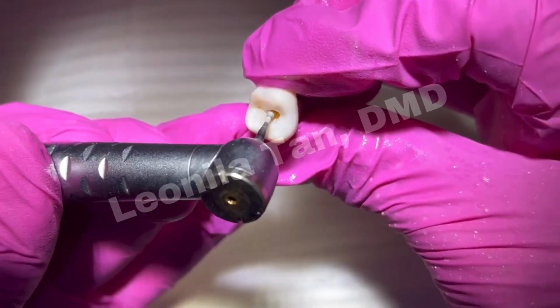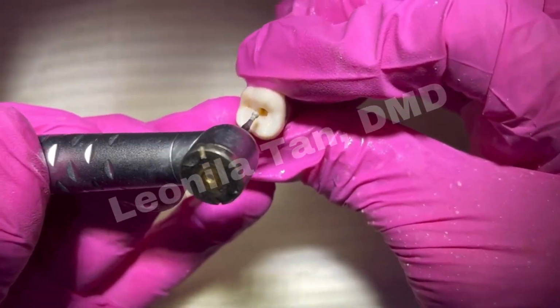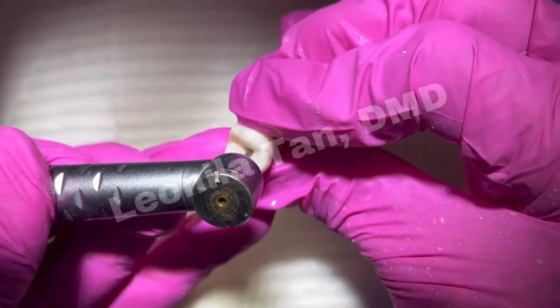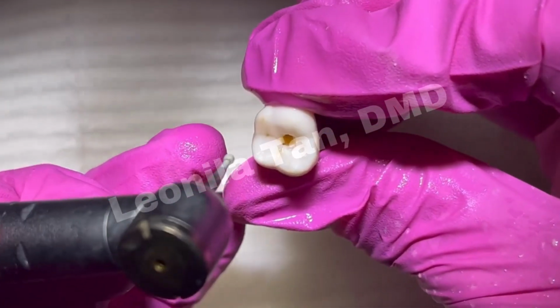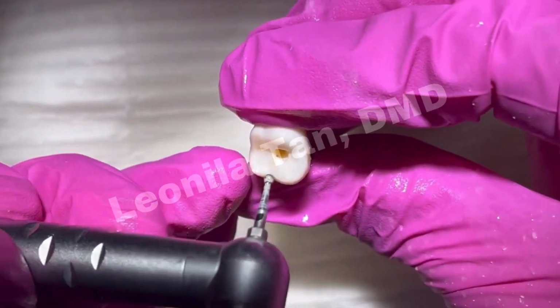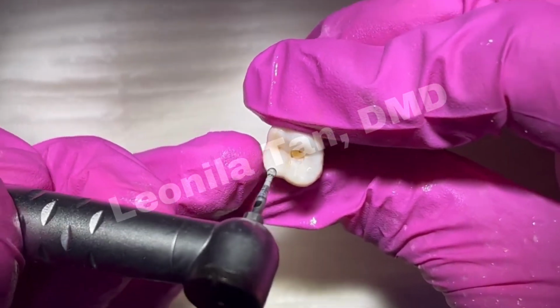Again, here we're starting to open. Notice it's an outward motion. You're following all those undercuts from your round burr. The moment you feel your drop, you only enter up to where your burr will catch. Don't go any deeper, because as you go deeper, you might hit the floor of your chamber.